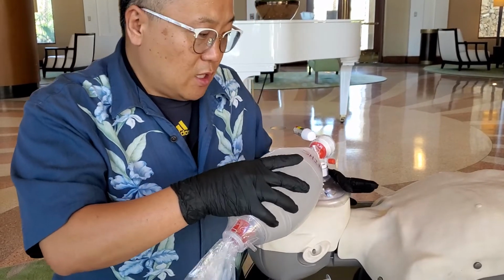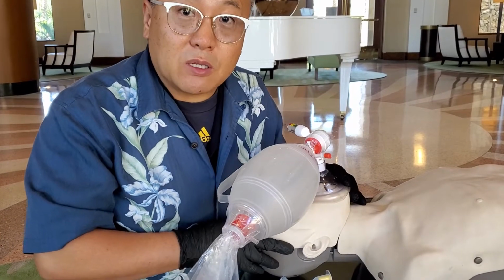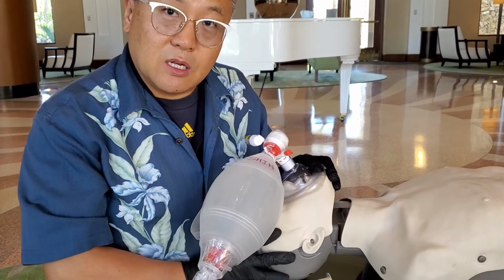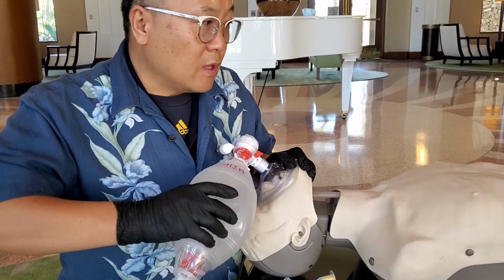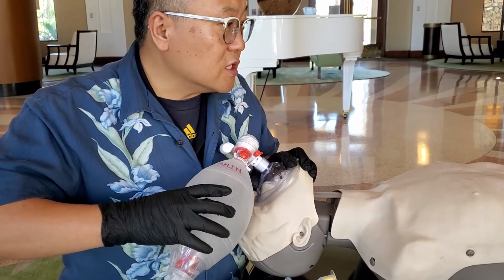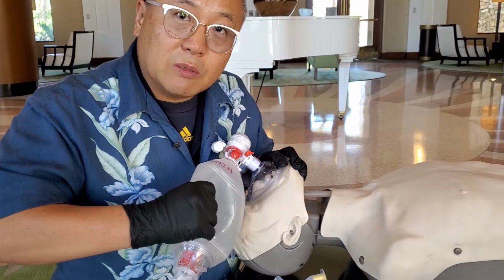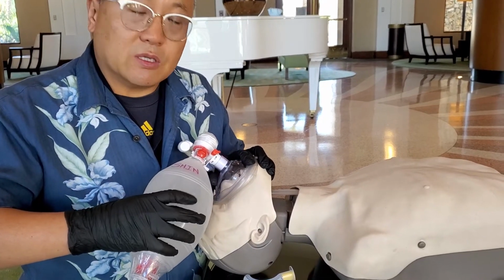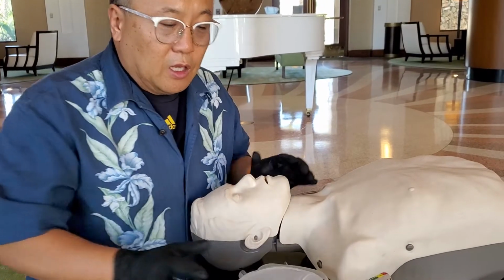Don't forget, if the patient is not suspected of spinal injury, you can use head tilt chin lift, like this, okay? Head tilt chin lift. Do you see the chest rising? That is a PPV, positive pressure ventilation, okay?